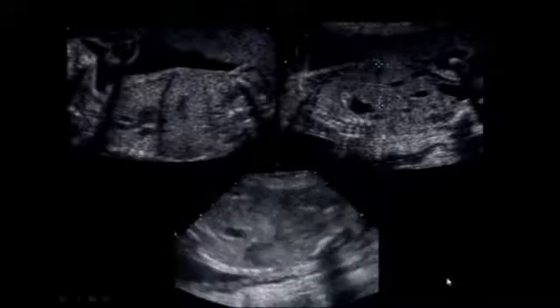Another patient with diaphragmatic hernia, we can see on the right side that the diaphragm is beautiful, intact. You see this black skinny line running along the top of the liver on the right. But when we go over to the left, you only see the diaphragm partially over here. And then when we look at the breathing movement, we can see this sort of corkscrew or curlicue. The top part is going down and the bottom part is going up through the hernia as the movement rotates the abdominal contents up into the chest.